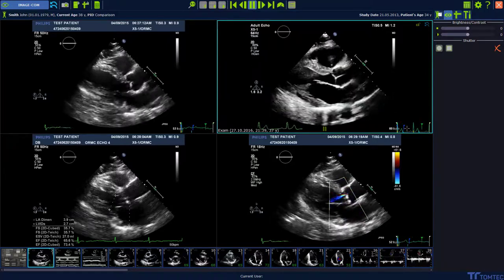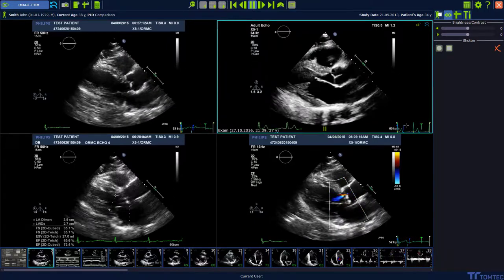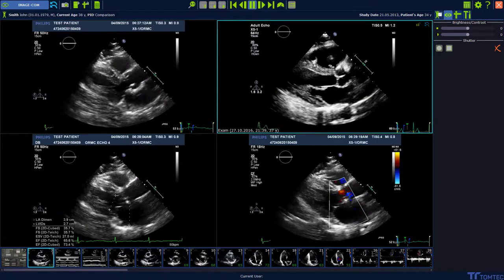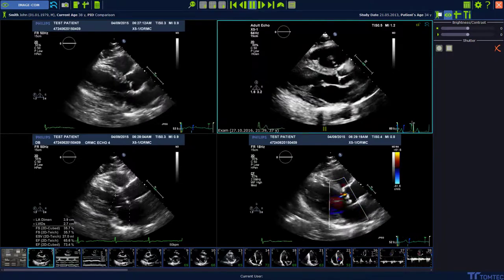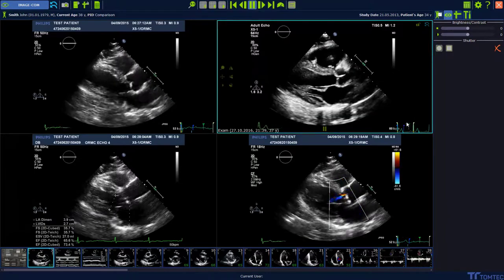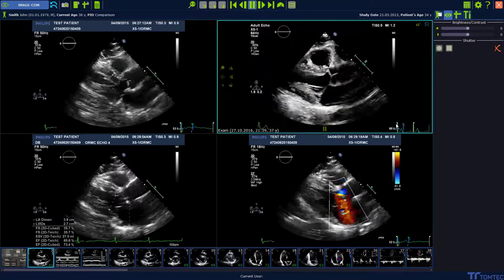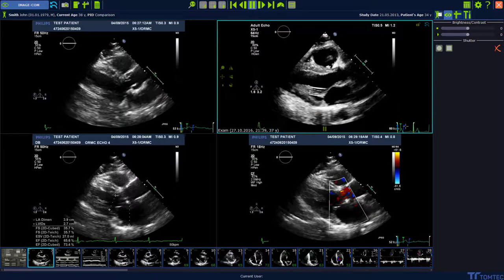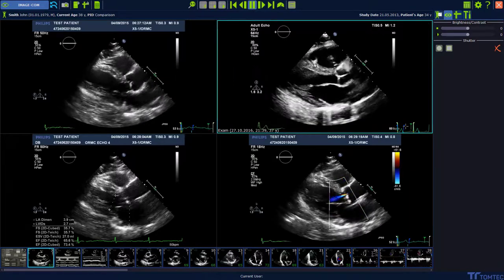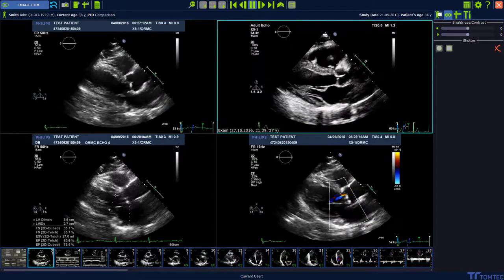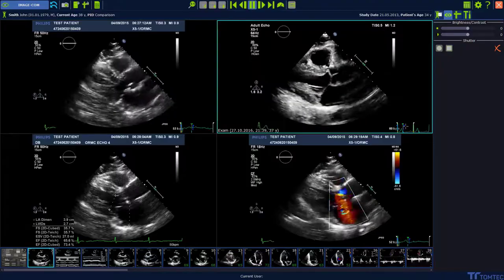For a comparison mode, sometimes loops of a prior study have more than one heart cycle. If so, you just need to double click on one of the heart cycles shown at the ECG in the right lower corner of each loop.